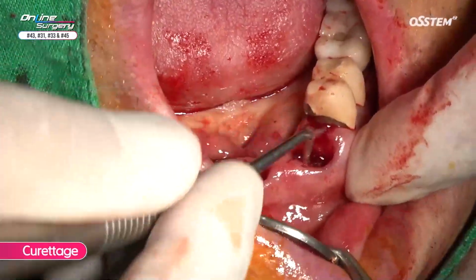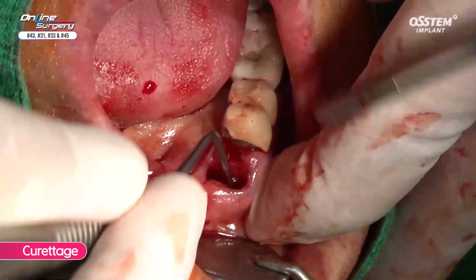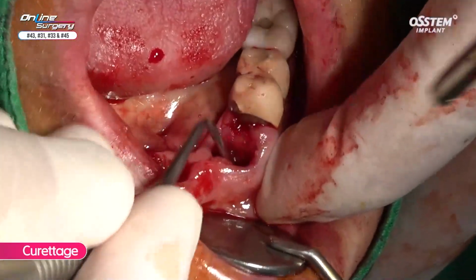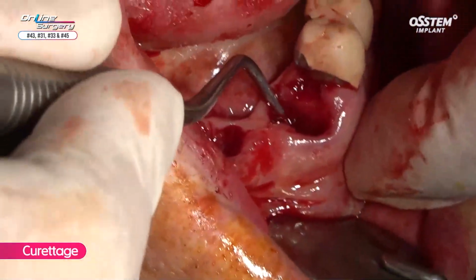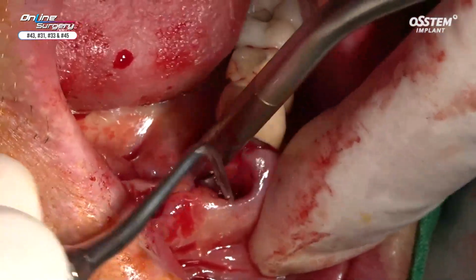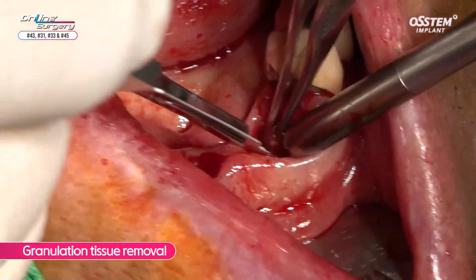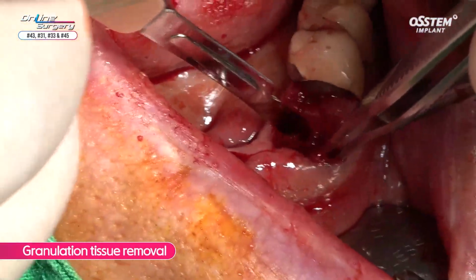Because it's not a canine, the root is divided into two. The buccal wall is completely resorbed on the apex, so you can see the instrument sticking out. For immediate implant placement, you need to remove granulation tissue for sure.